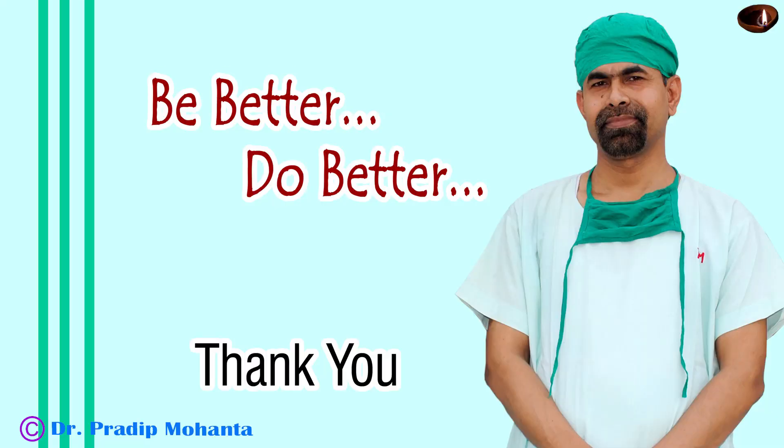Thank you very much for your attention. I hope this video will encourage you to manage soft cataracts in this way. This is a very safe technique — just tilt the nucleus and start eating up the nucleus from above.